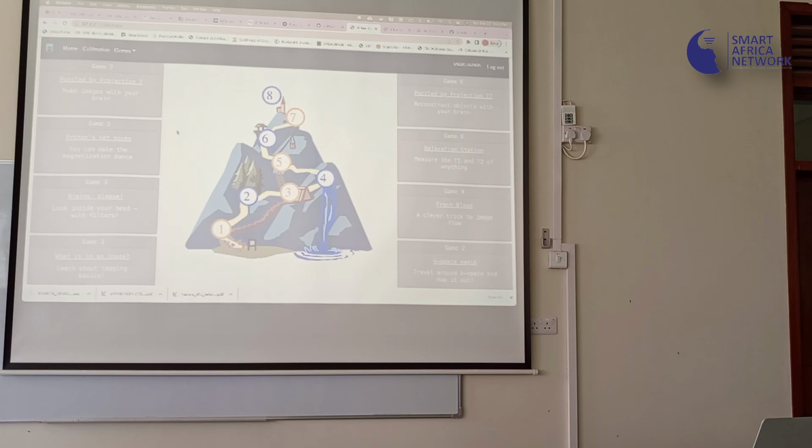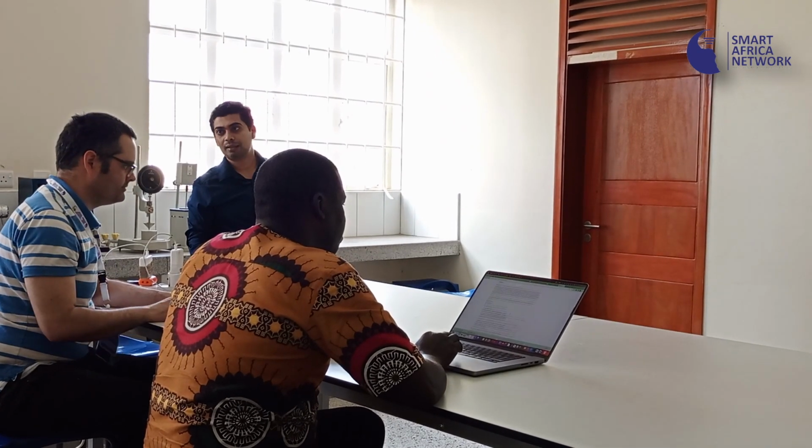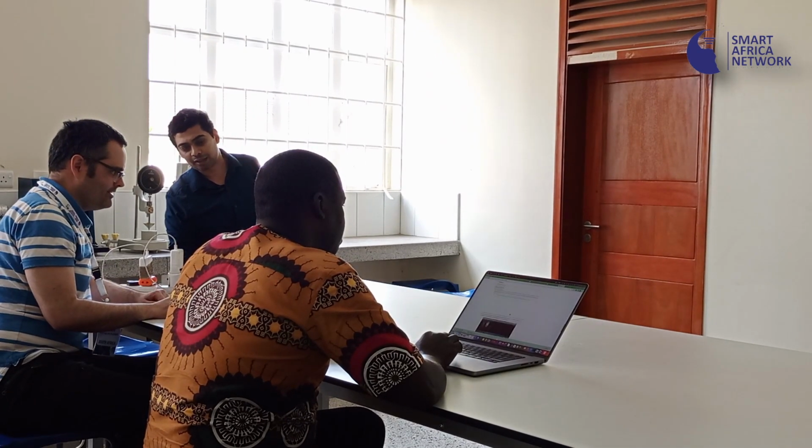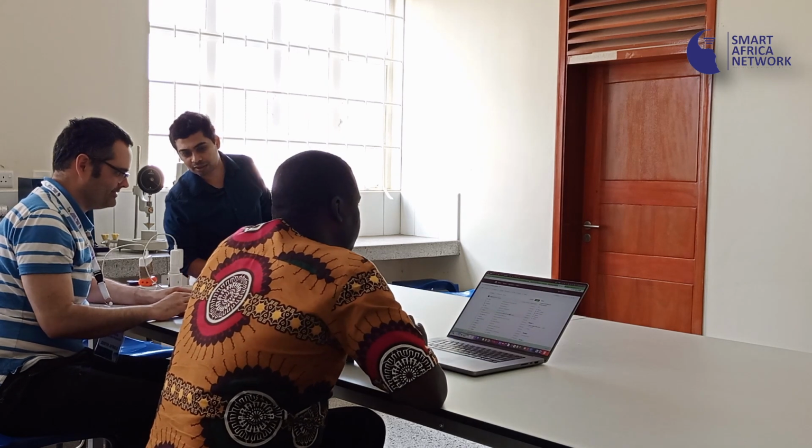How do I get to that? You have to install it. Yeah, you have to install it, and those are the installation instructions. If you type virtual scanner, VS tabletop, if you Google for VS tabletop GitHub, it gives you a bunch of different ways to start. So that should give you the installation instructions.